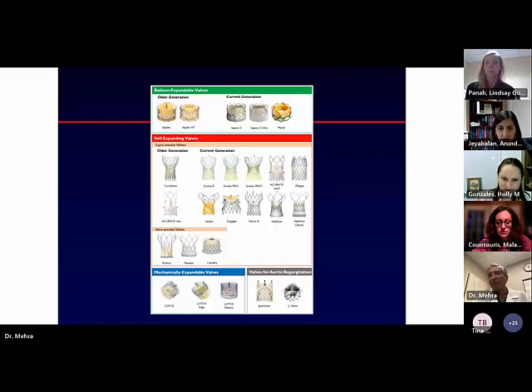In the self-expanding valves, there are 2 different types. One which is called an annular plane valve, or which is implanted at the site of the aortic annulus, which is the Portico valve, and the Evolut, which is a series, which is the Evolut Pro now, and Evolut Pro Plus, which is a supra-annular valve. The mechanically expanded valve, which is the Lotus valve, has essentially been discontinued because of high risk of pacemakers.